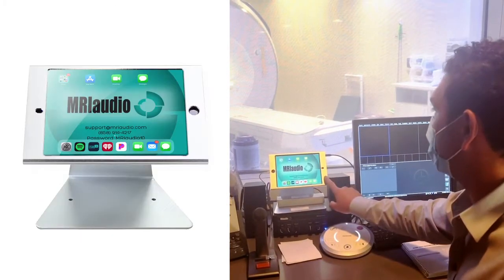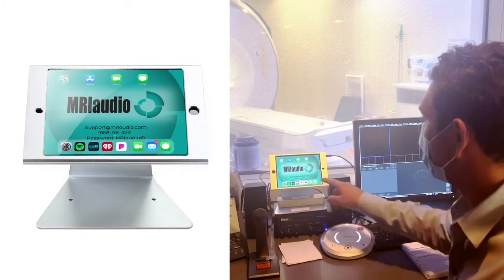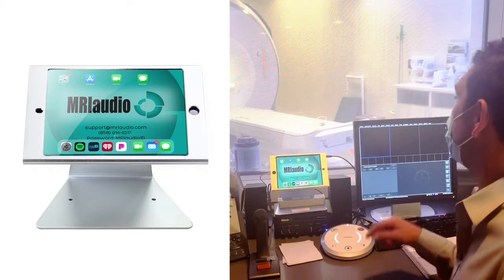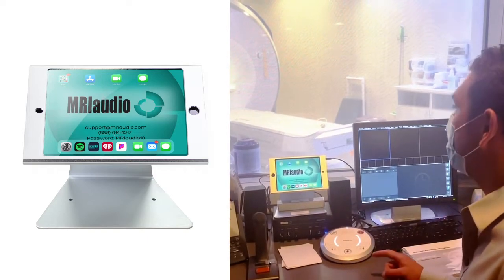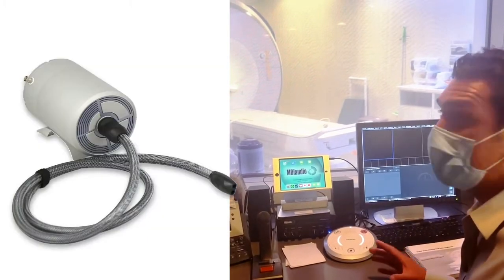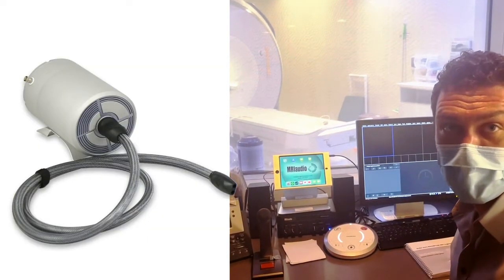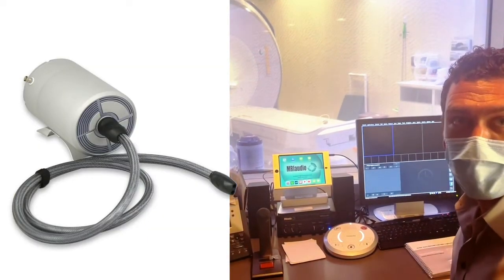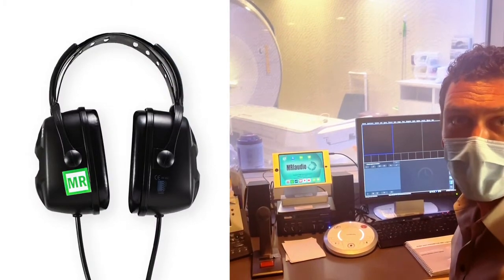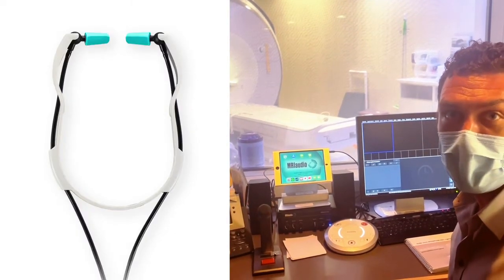The system also includes an iPad that acts as the music source, and inside the MRI suite there is a sonic transducer connected to a pneumatic tube that plugs into our over-ear and in-ear headphones.